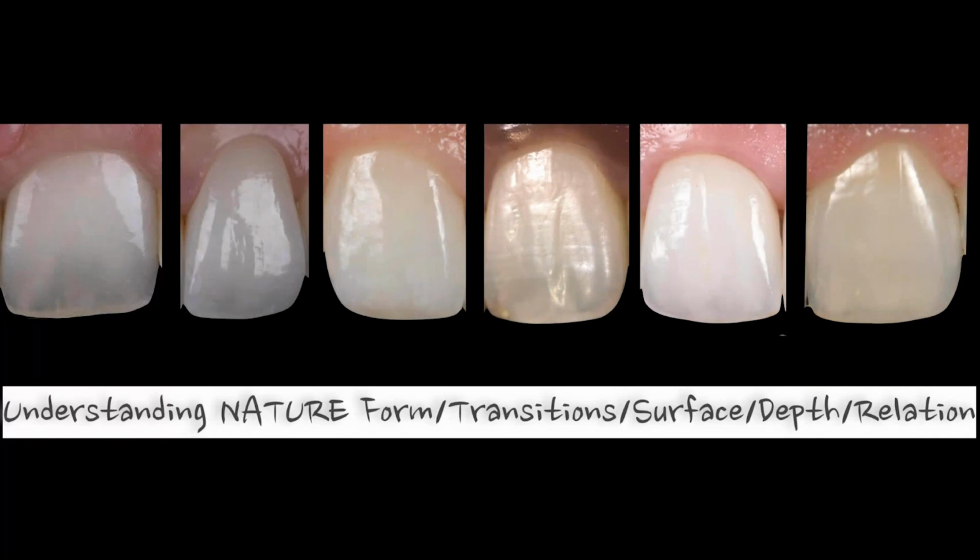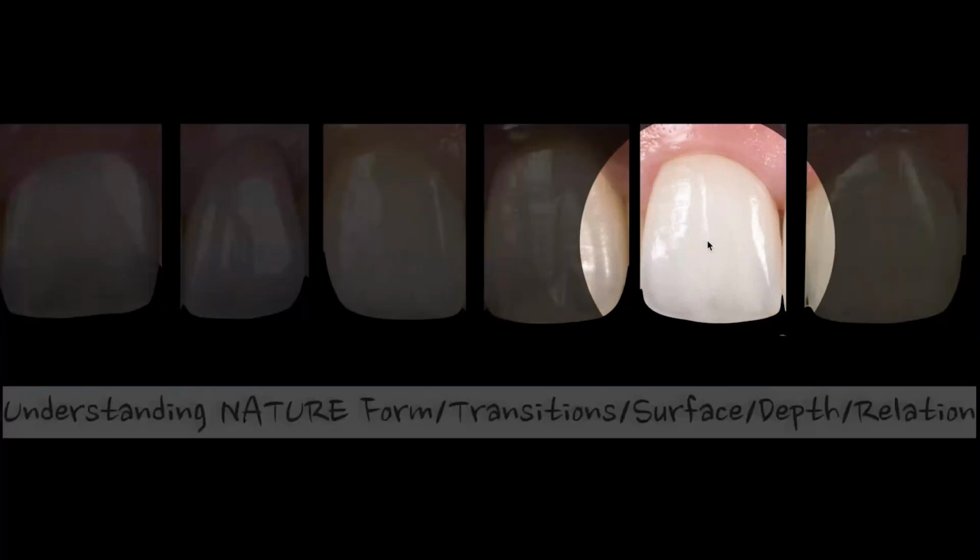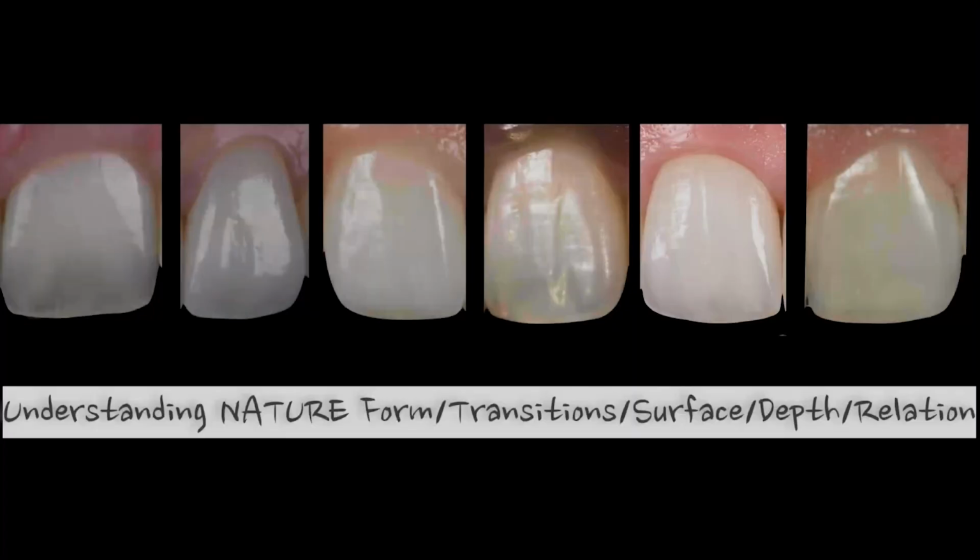Now, there's one that stands out as obviously fake, and I always defend myself with the one that stands out as obviously fake because I was matching another crown when I made it. So I think if you guys all guess that this is the fake one here, yes, I was matching another restoration that I don't think I made that I was trying to match it to, and it does stand out as kind of fake looking. But let's take a different angulation on this, and let's look at it from a surface texture point of view.